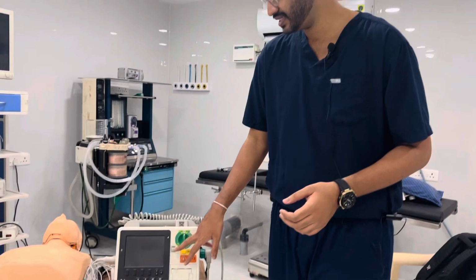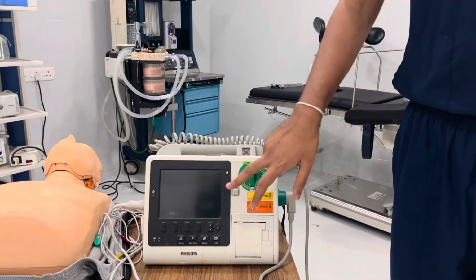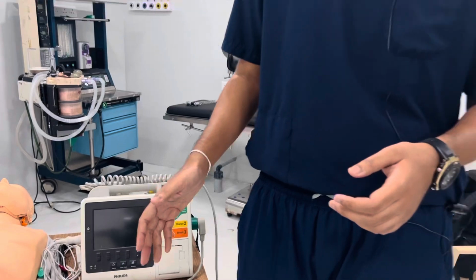The main thing is you have to press the sync button. If you look at this defibrillator, you see a sync button. Before cardioverting, before giving the shock, you should not give the shock directly. You have to press the sync button, then apply the shock. Some people have a doubt about why you have to press sync. Ideally you press the sync button because the shock will be delivered at the peak of the R wave. That's the concept. The machine will analyze the rhythm and at the peak of the R wave, the shock will be delivered to the patient.